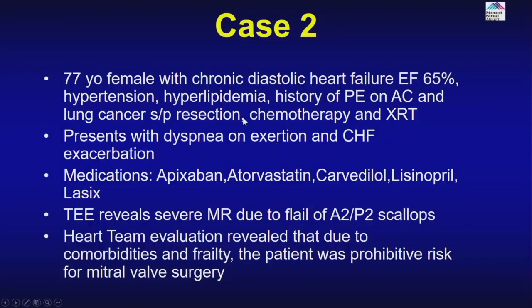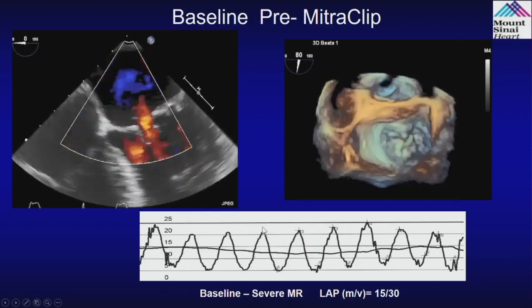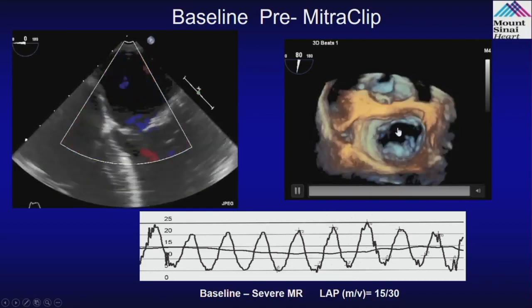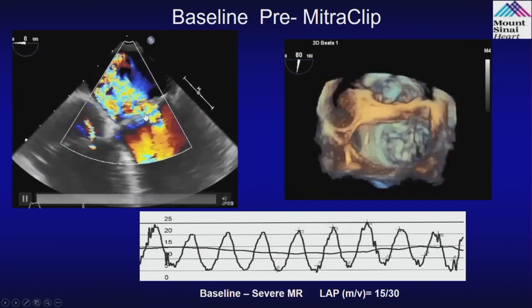So this is the end result. Case 2 is another patient. If you see, these are patients with multiple comorbidities on good medical therapy, which would include Lasix, ACE inhibitor, beta blocker, and then they continue to have heart failure. These are the kind of patients that are referred to us. So if you see here, same big V waves close to 25 on medical therapy, and nice prolapse. Look at the MR, significant MR.